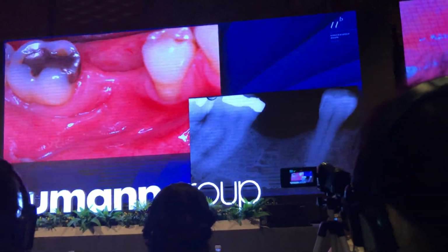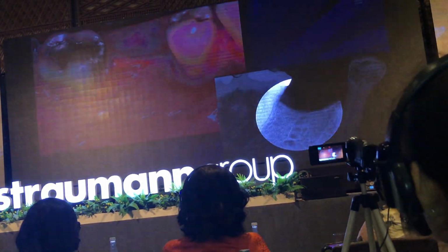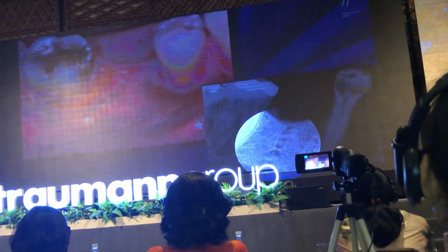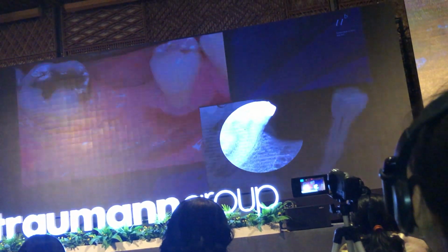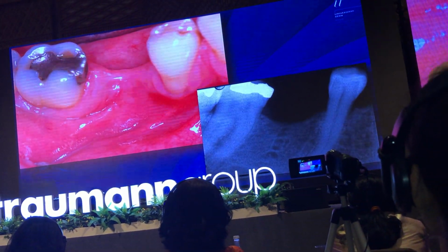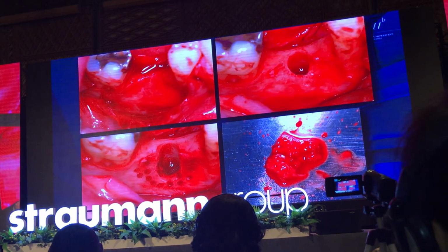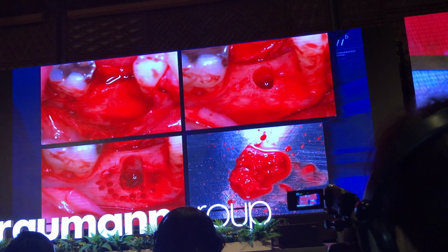And you see, when he came in, it was heavily atrophied, with not too much keratinization. When you look at the periapical, you see this typical sign here. When it's atrophied, you often see these bubbles in the radiograph. That's not a good sign. The good thing is that he has an adjacent tooth to the distal and one to the mesial. There the bone is white because of the root. In the middle it is atrophied. And that's exactly what I found. We opened up and you see it was heavily atrophied.